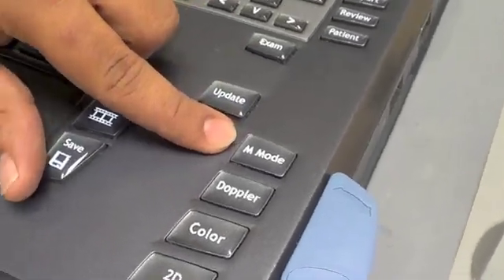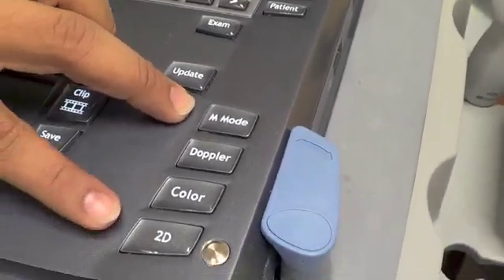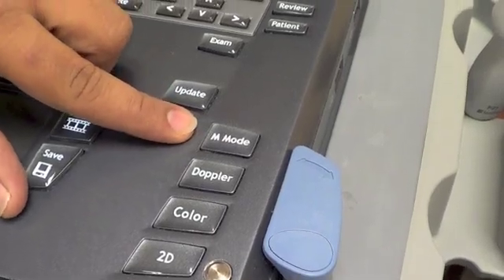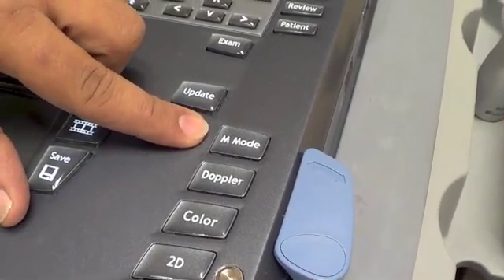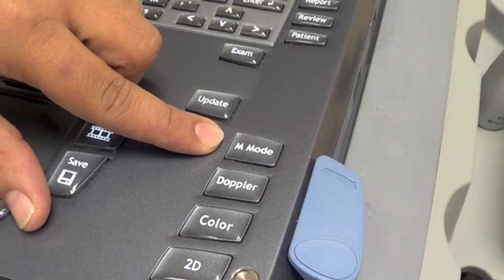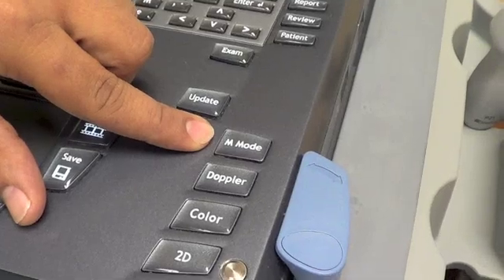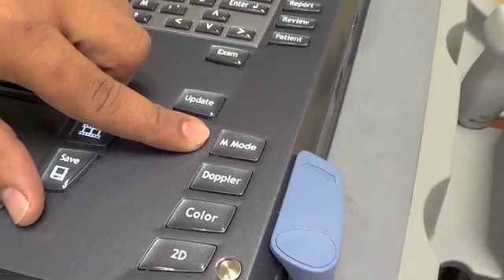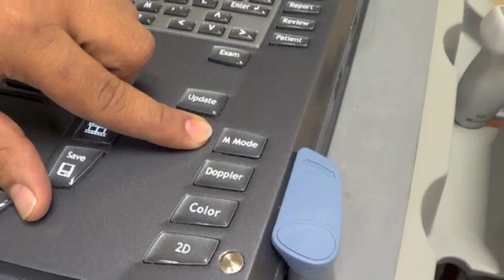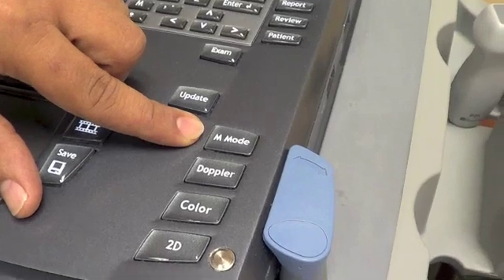The last mode we want to talk about is M mode, which stands for motion mode. Along with bright mode, M mode is one of the most frequently used modes. When you press the button, it gives you a line that captures a four, five, or six second clip — depending on your machine — of that particular segment.